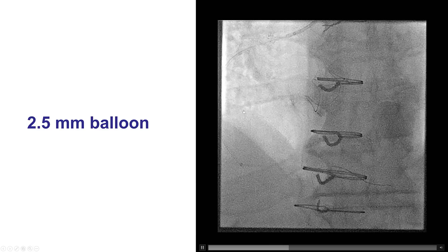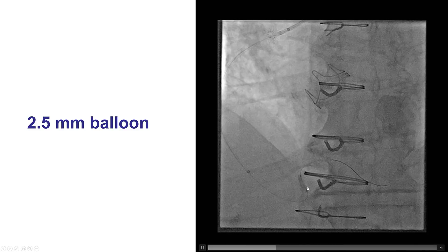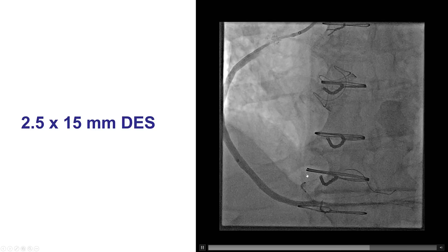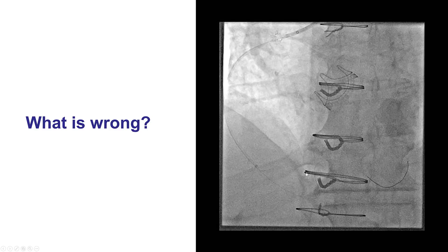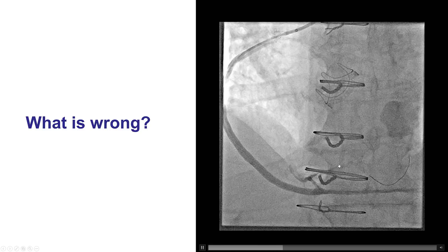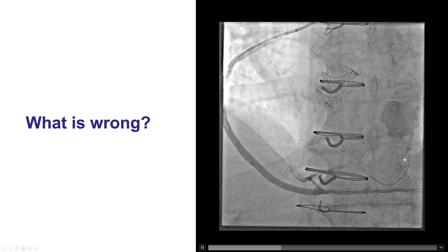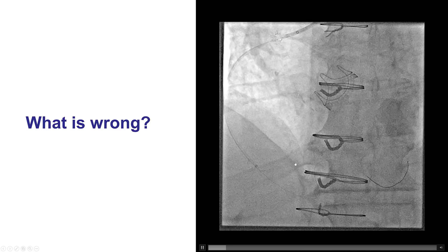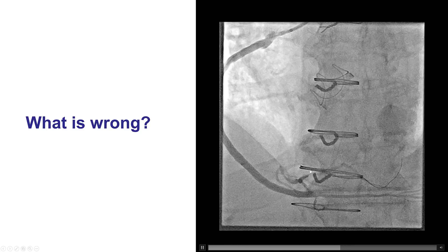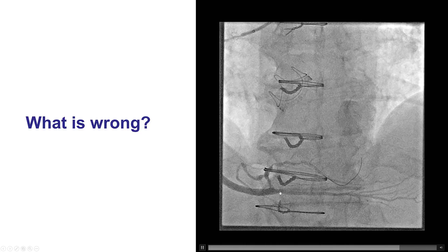We predilated a little more with the support of the TrapLiner — delivery was not too bad, especially with the Grand Slam wire. We were finally able to deliver a 2.5 by 15 mm stent, which was successfully deployed. When we took a picture, we realized there was a problem. The Grand Slam guidewire — when we rewired without visualization through the Caravel during acute occlusion — was actually out of the vessel, just in a small branch.